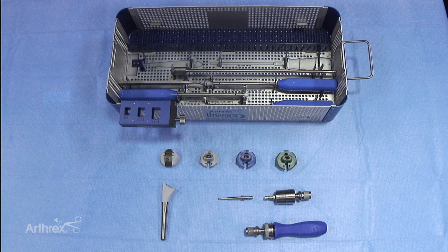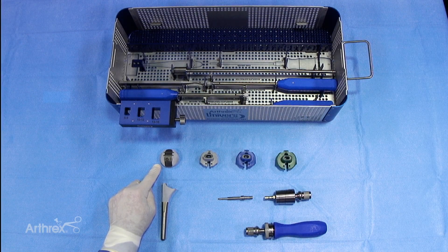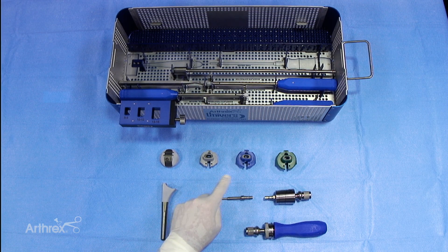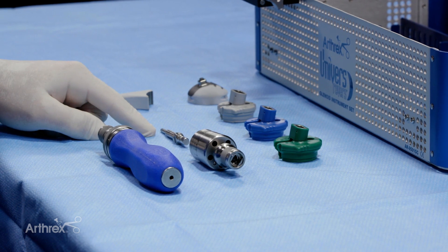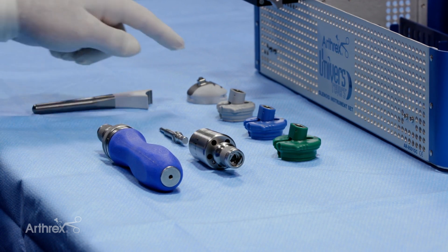The different aspects of putting this all together include the stem itself and the universe reverse cup. We also have the alignment guides which are made for each of the various sizes: the 36 millimeter, the 39 millimeter, and the 42 millimeter. We also have the short screwdriver with the T15 tip, which matches up with the screw inside of the cup.